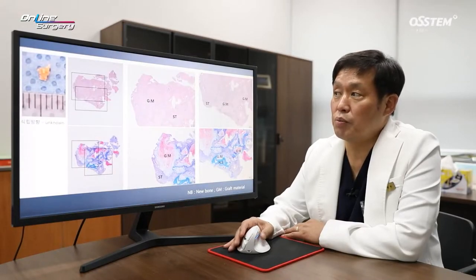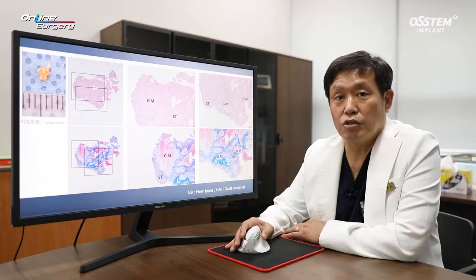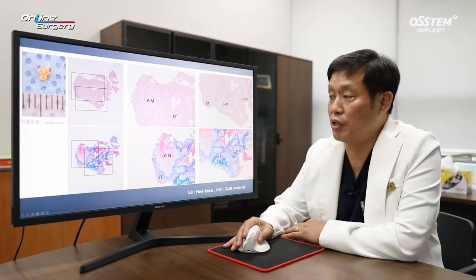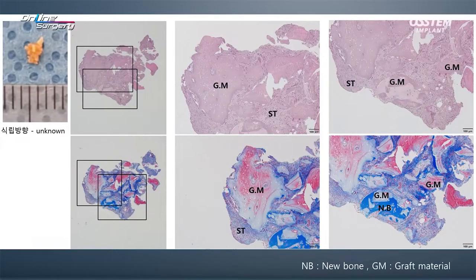During surgery, we biopsied the area where AOS collagen was grafted. As you can see in the biopsy, new bone formation is observed around the graft material. This is after 4 months since AOS collagen was used and new bone formation can be observed. If I had waited 6 months, more new bone would have been generated.